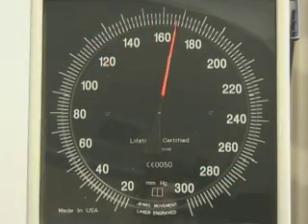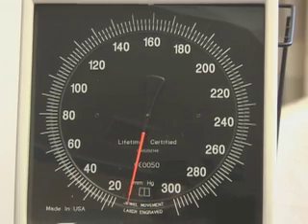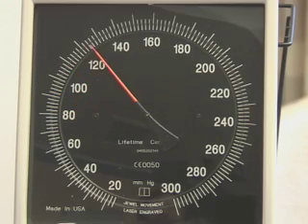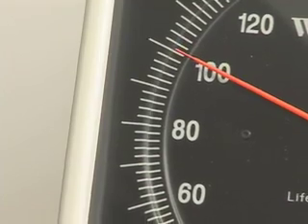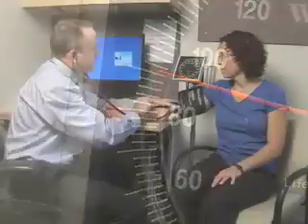Inflating the cuff to some arbitrary level runs the risk of excessive overinflation. To avoid this, determine the measurement of the pulse obliteration pressure. Rapidly inflate the cuff to 80 millimeters of mercury while palpating the radial artery pulse. Continue to inflate in 10 millimeter of mercury increments, taking note of the reading at which the pulse disappears. Then deflate the cuff at a rate of 2 millimeters of mercury per second, noting when the pulse reappears. Once the pulse obliteration pressure is determined, you are ready to measure the blood pressure.